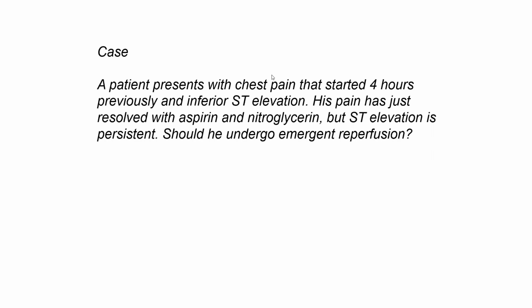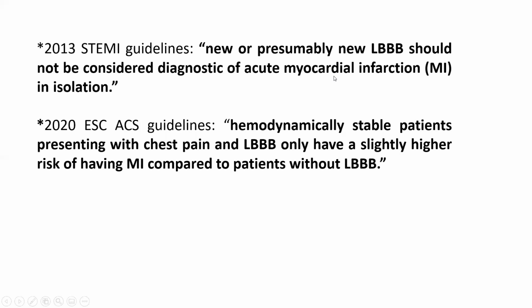Roy is asking about right bundle branch block. So yes, prognostically speaking, in STEMI, right bundle branch block is as bad prognostically as left bundle branch block. So if you have a true STEMI with right bundle branch block, your prognosis is as poor as a true STEMI with left bundle branch block. Acute right bundle branch block with a STEMI implies acute proximal LAD occlusion. So it's before the first septal. It's the first septal infarction that causes right bundle branch block. It's a big LAD infarct that causes right bundle branch block.